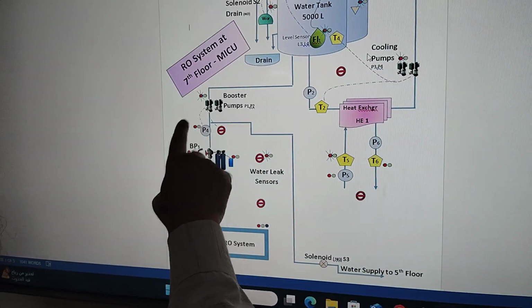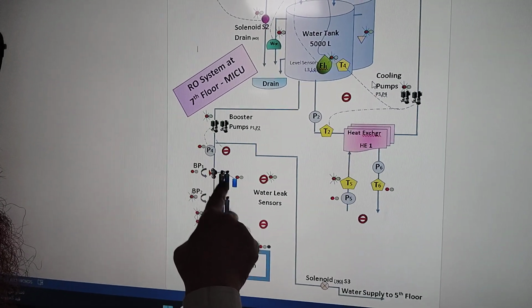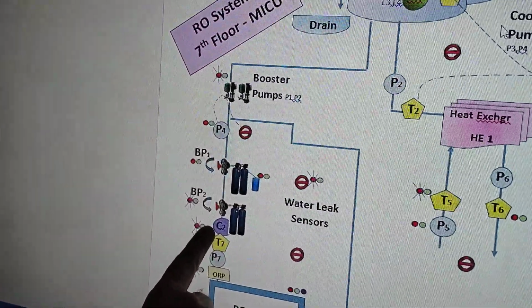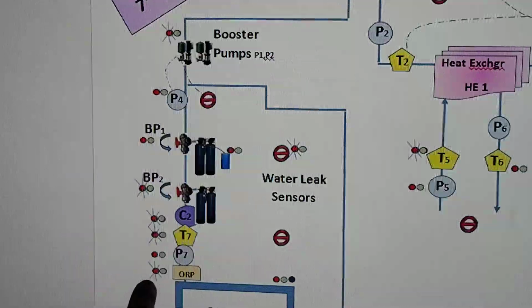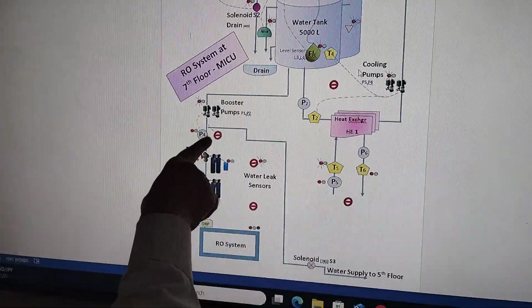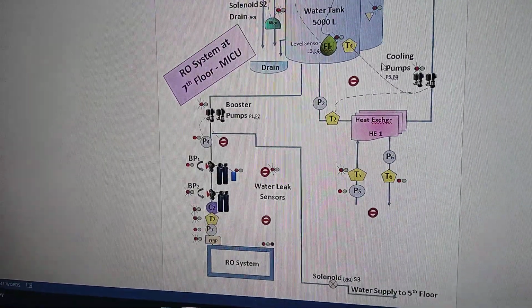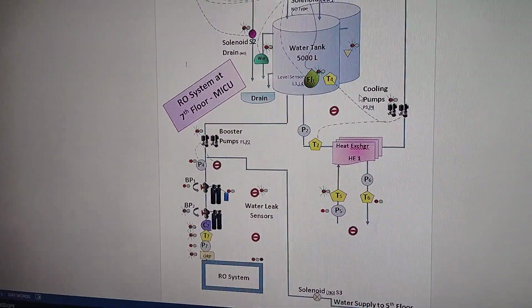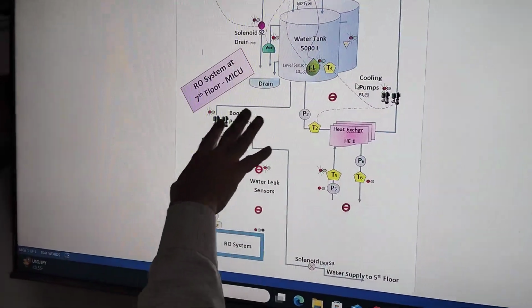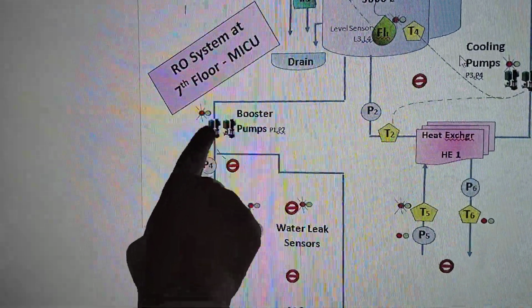It passes through the booster pump and pressure sensors, and then the softener and the carbon filter and conductivity sensor, temperature sensor, pressure sensor, and ORP sensor. So once the water comes in, it will try to build up the pressure. These pumps will build up the pressure to 4 bar. Once the pressure is reached, it will switch off the pump.